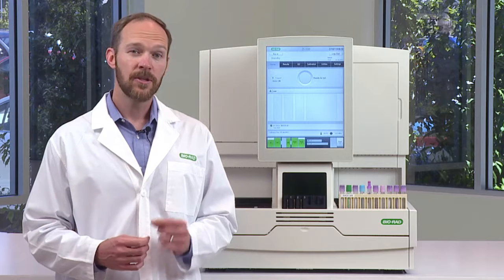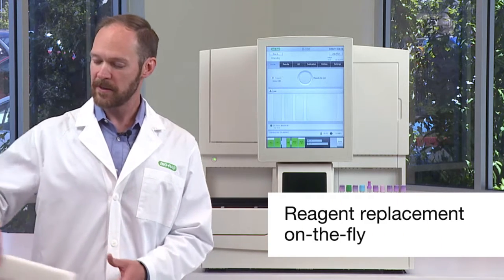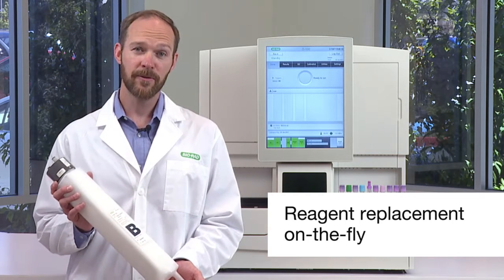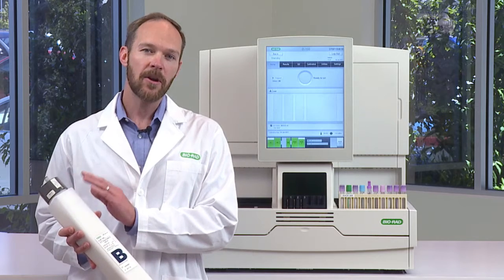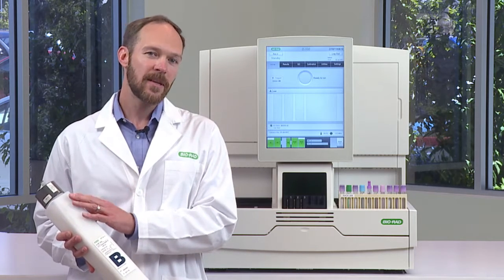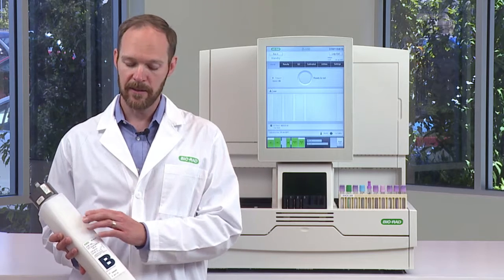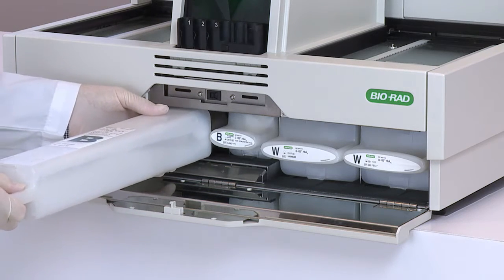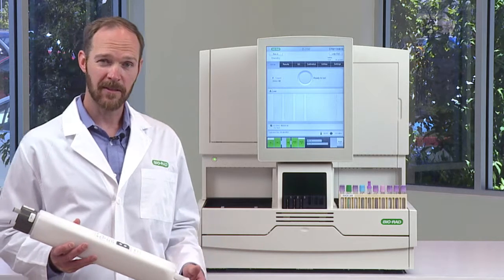During the run, should you need to change any of the reagents, you can do it without stopping the system. Here's an example of a D100 buffer bottle — this is buffer B — and notice that it also has an RFID tag, transmitting all the necessary test parameters to the D100 automatically. All you do is open the reagent compartment on the front, snap it into place, and close the door. That's it.